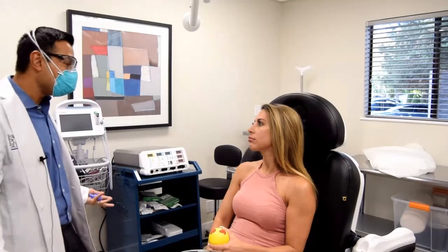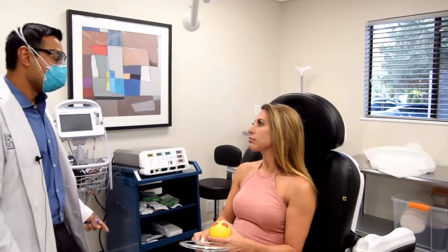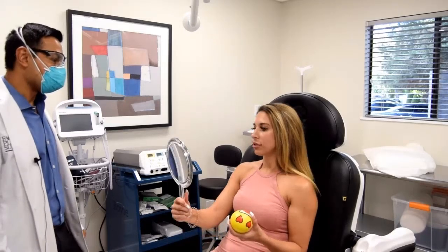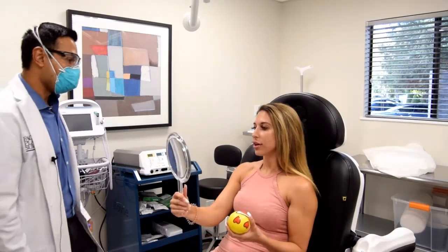So what you get now is kind of what you get. You have a little bit of swelling but you're going to have a result very similar to this. It looks really good.